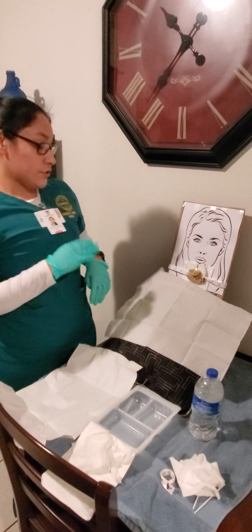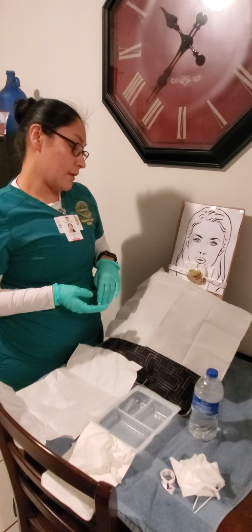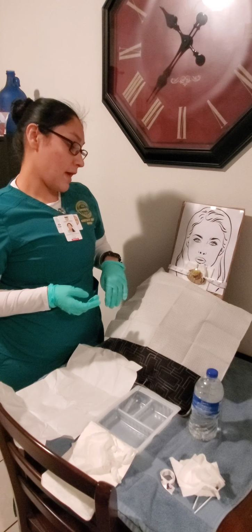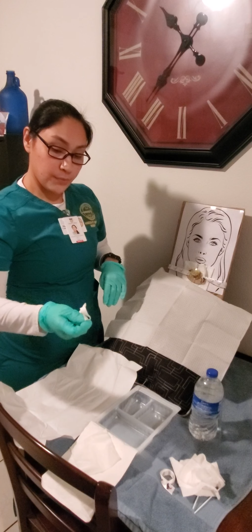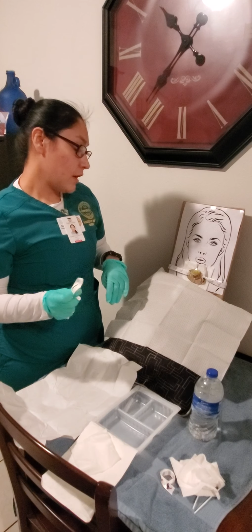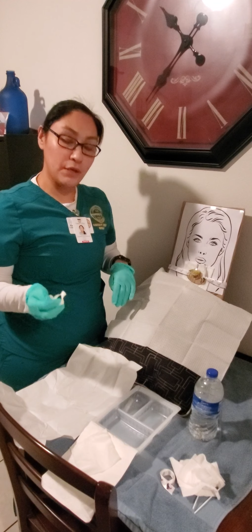Okay, so now after your clean gauze is already on, you can go ahead and then proceed to apply the new trach ties. Just make sure that you do apply the new one before you remove the old one.